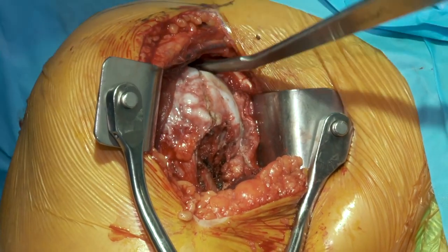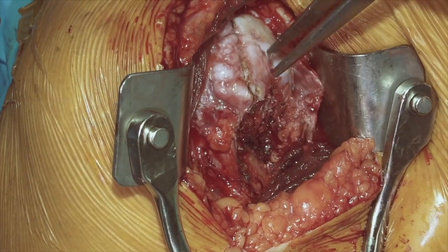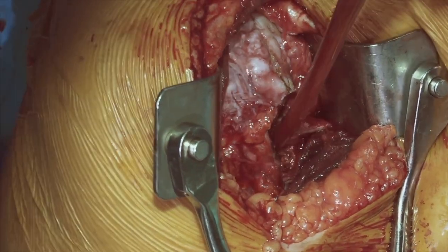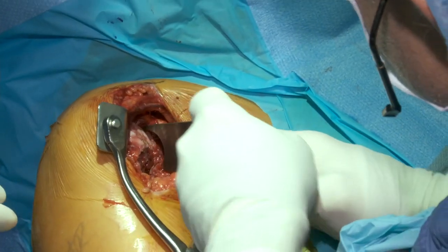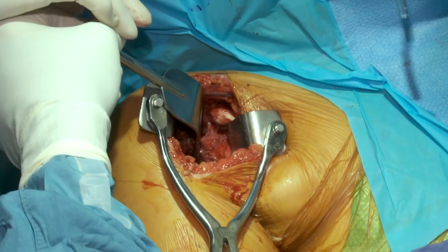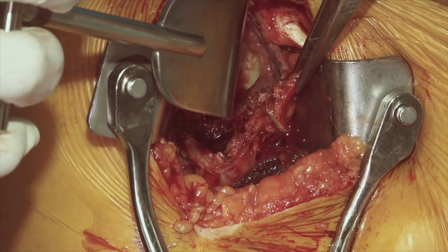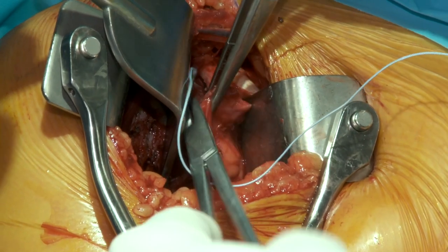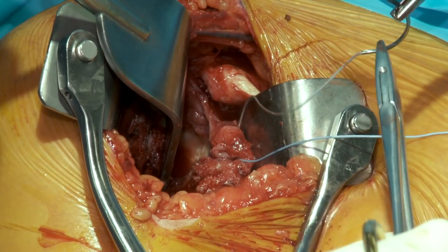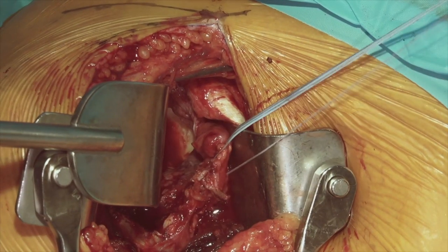We'll take our Hohmann retractor out and put our sutures in our subscapularis — which we routinely do, but again this is very deficient. We'll take our Fukuda retractor, internally rotate the humerus, place it across the glenohumeral joint, catch the posterior glenoid, and sublux the humerus posteriorly to get a better view of the subscapularis. We'll take our number two FiberWire and use two of them to control this tissue. Even though we may not repair this at the end of the procedure, we want to prepare for that in each and every case.